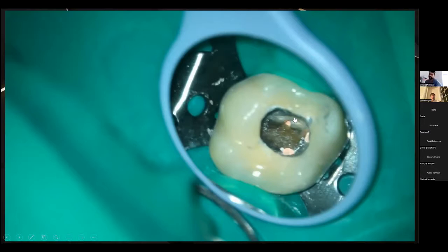So on a case like this, he was diabetic, 80 years old, very high bacterial load in that area. If we do need to go in surgically, which to be honest, I think likely we will need to, it also makes things a lot easier, because unless we've got that isthmus between the MB1 and MB2, there's going to be no retroprep to do. We can just cut off the roots, and yeah, it does make life a lot easier when you've got CBCT and these type of materials to plan these type of cases.